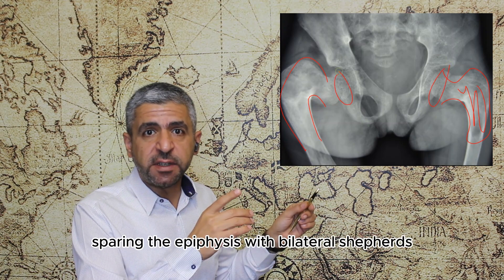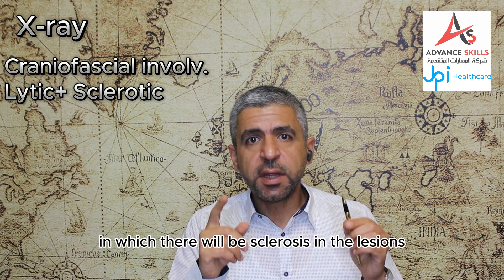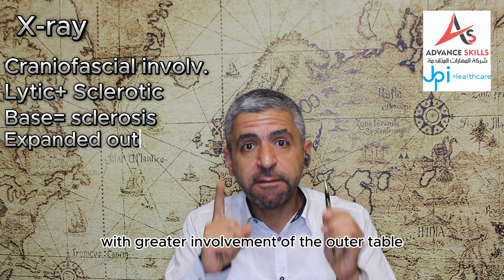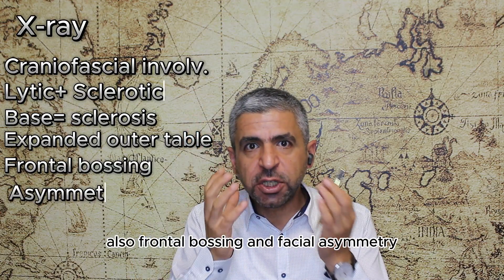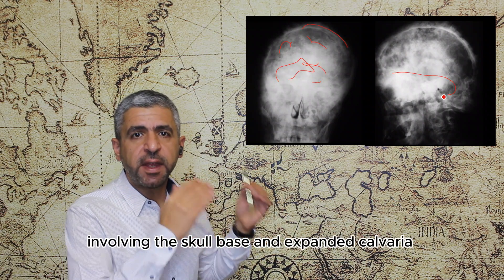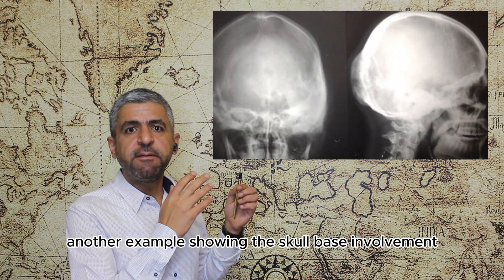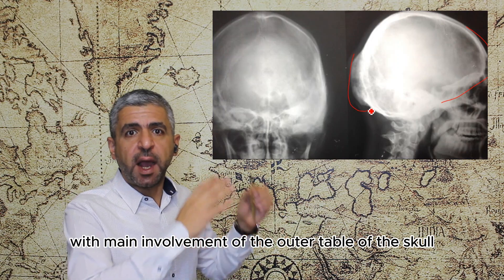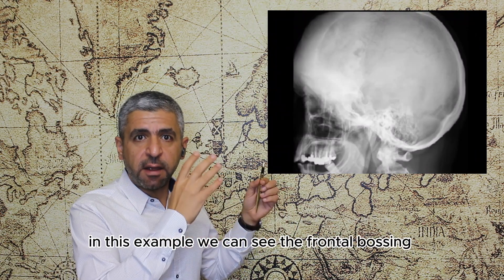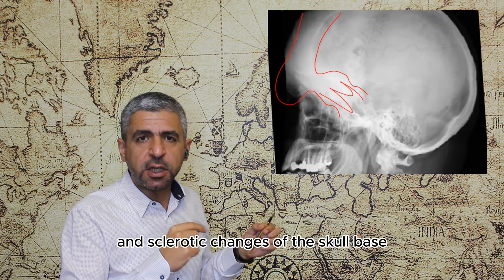Bilateral radiolucent expansile medullary lesions with ground-glass appearance sparing the epiphyses and bilateral shepherd's crook deformity can be seen. In craniofacial involvement, there are mixed lytic and sclerotic lesions with sclerosis at the skull base and expanded calvarium with greater involvement of the outer table, frontal bossing, and facial asymmetry. Examples show skull base involvement as a sclerotic lesion, outer table predominance, and sclerotic expansion of the frontal bone with skull base changes.